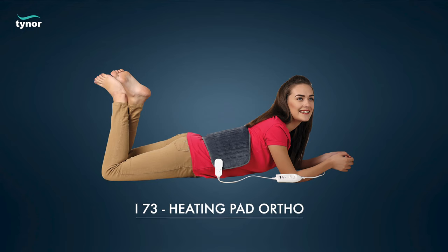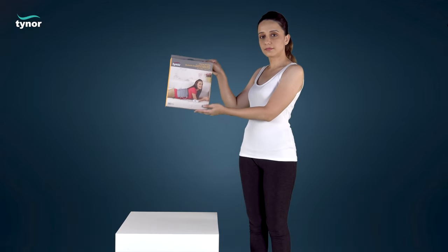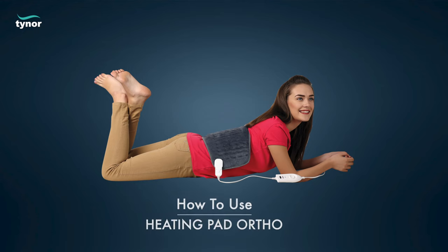Here we will discuss how to use the Heating Pad Ortho. The Heating Pad Ortho is available in universal size. Let us see how to use it.